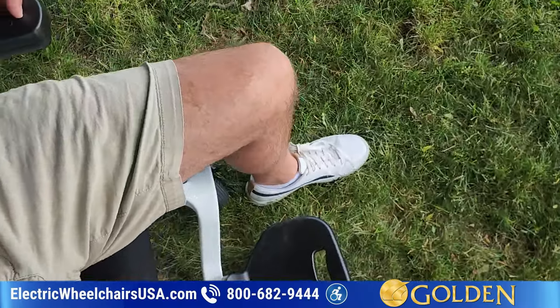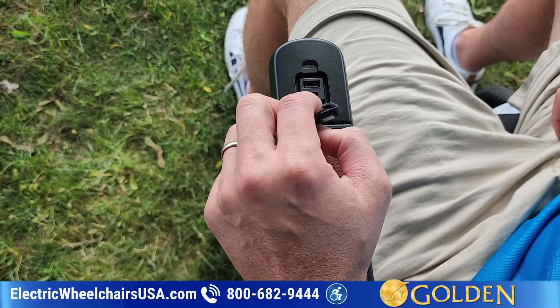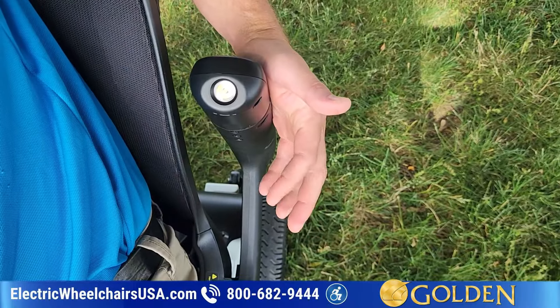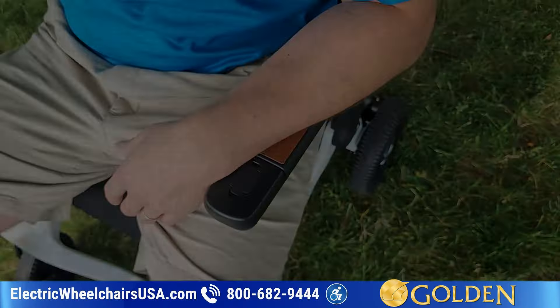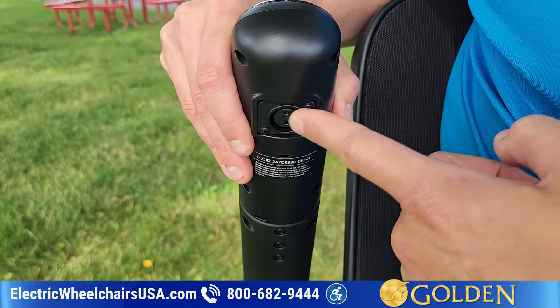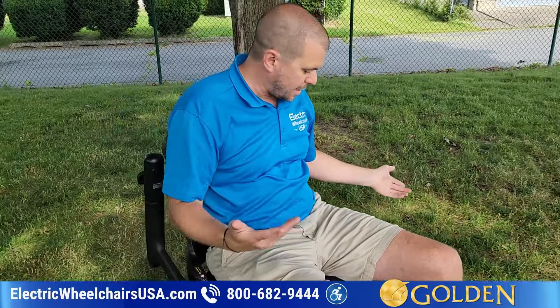Also on this side, you have a USB charging port so you can charge your mobile device, and there's a micro USB charging port as well. There's also a headlight right here, which you turn on by tapping it — it's really sensitive, kind of like a touch lamp. That's how you would turn it on if you want to ride in the evening. The other charging port I mentioned previously is located right here on the armrest, so you can charge the battery directly on the armrest. The armrest also flips back in order to get in and out easily.